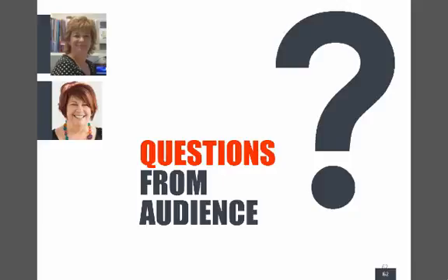Okay, we got any questions from the audience? Sam, Lisa's wondering where the 150 litres difference comes into it. That's the definition from the Asthma Council. Millilitres. So the definition for asthma is an increase in FEV1 of 12% and 150 mils. That's it. Yeah.